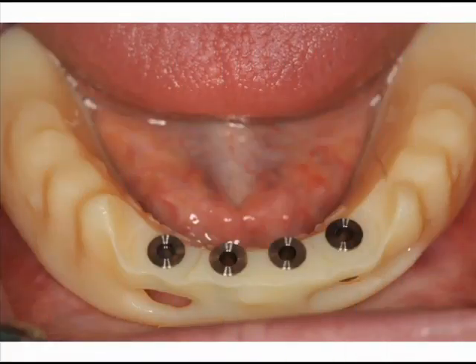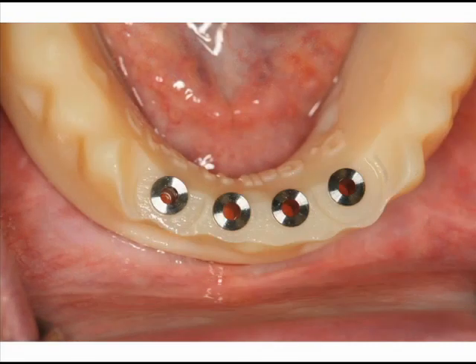Figures 12 and 13 show the surgical guide and directional sleeves for a very narrow diameter pilot drill. This was fabricated as a duplication of the patient's existing conventional mandibular denture.